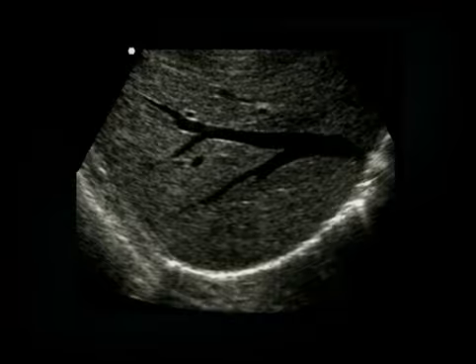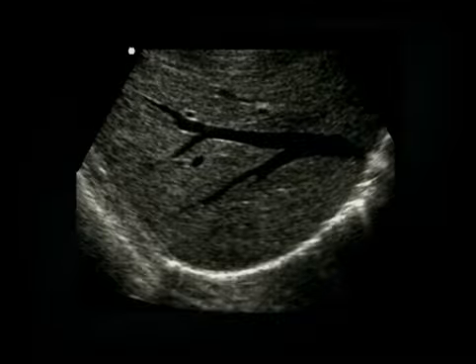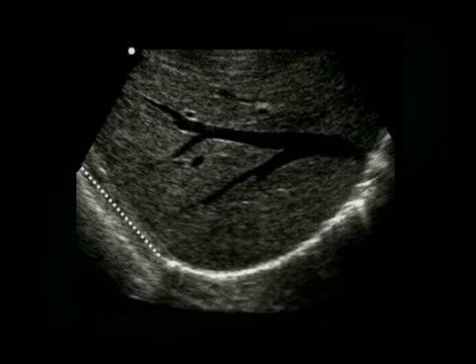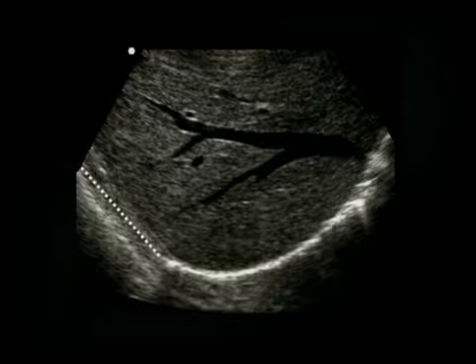Large flat surfaces act more like mirrors. This view shows the liver with the bright curvilinear echo of the diaphragm along the back of the image. Notice that a portion of the diaphragm is quite bright and well defined, but as we go to the left side of the image, we see that the diaphragm fades from view.